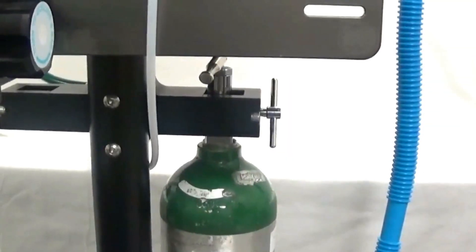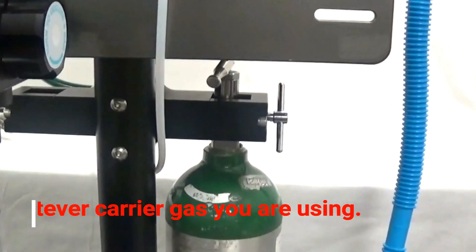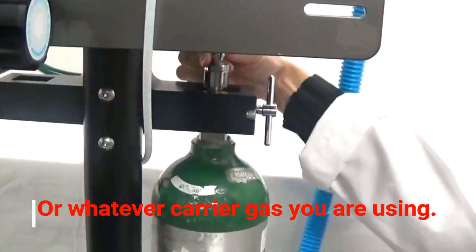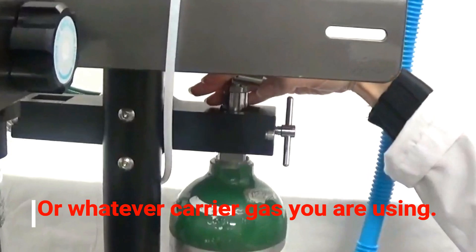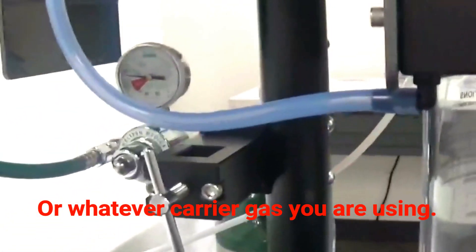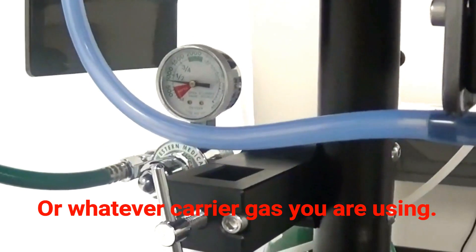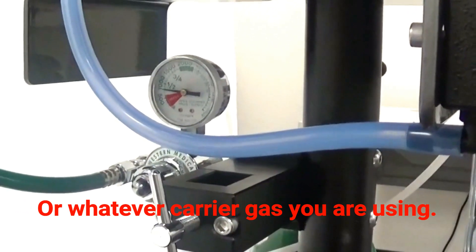It is now time to turn the oxygen source on to the anesthesia machine. Give it a couple of good turns so that there is plenty of oxygen flowing through the manifold. We are about just under half full, so always make sure there is enough oxygen to complete the verification of the vaporizer.